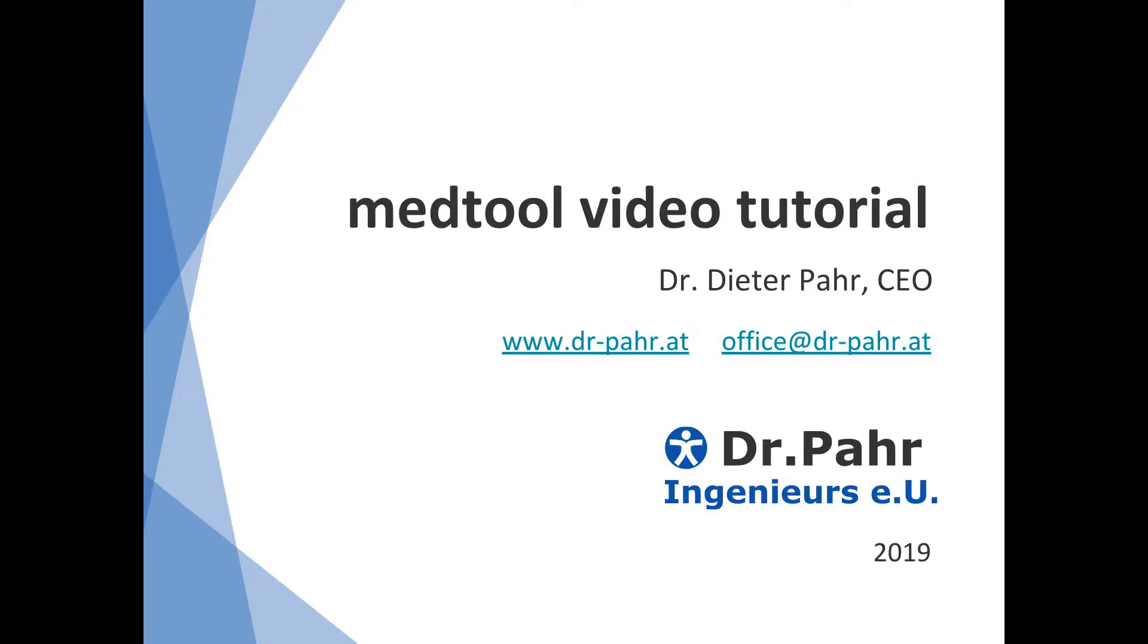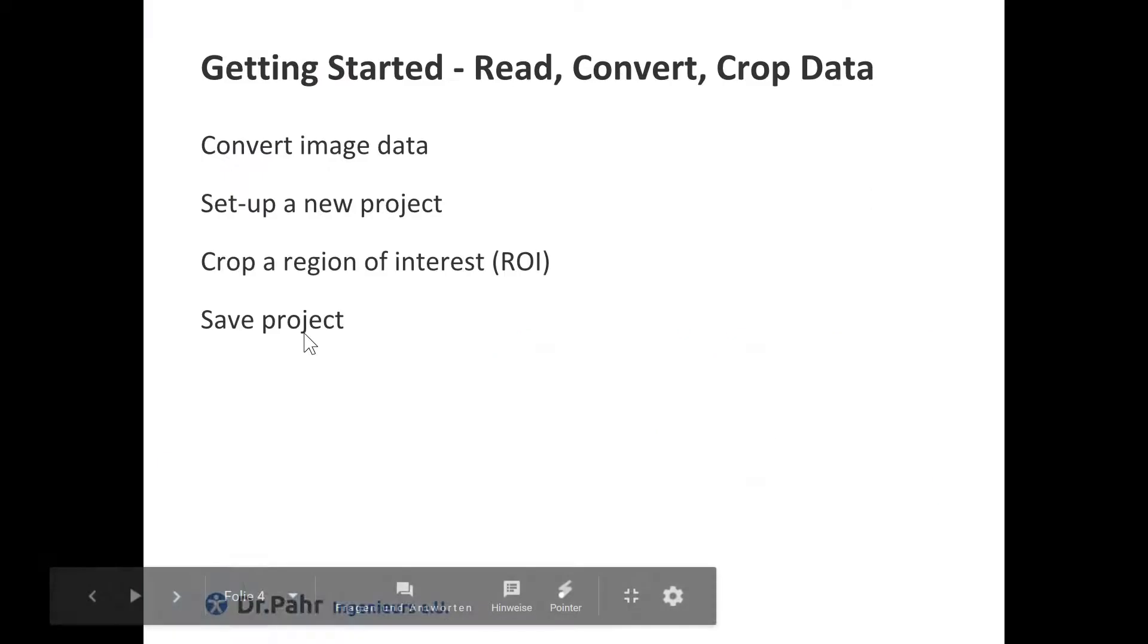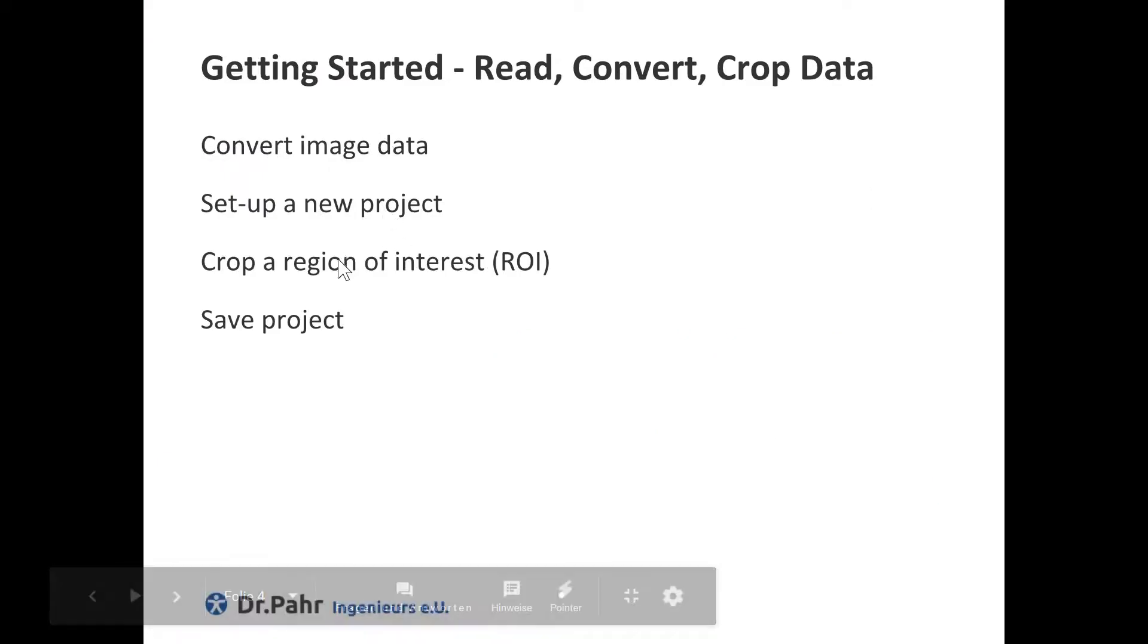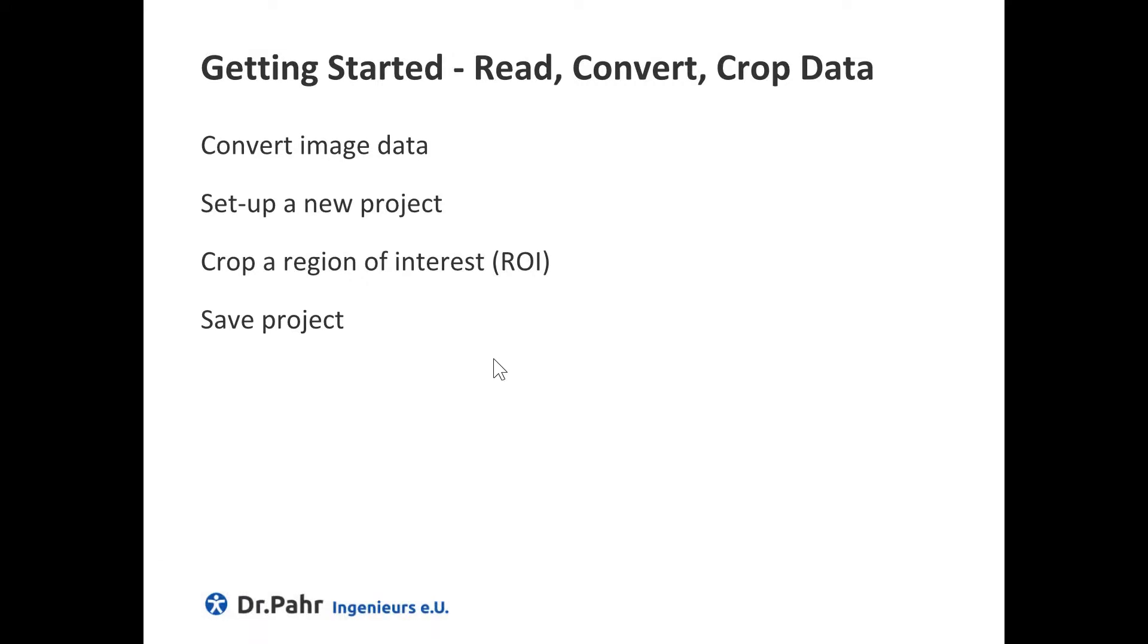Welcome to this Medtool video tutorial. In this tutorial I show you how to convert image data, set up a new project, crop a region of interest and save the project.